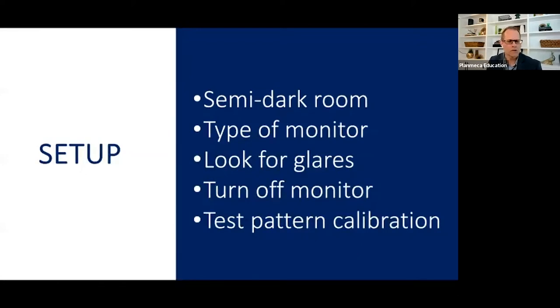One of the recommendations I would say is look for glares on your screen. So I have lights around me today that are cast so they are not providing glare on my screen. So the best thing you could do is turn off your monitor, not right now, but when you're in front of a 3D image, feel free to turn off your monitor and look at the reflections in the monitor to make sure that you're not getting any ambient light that might be reflecting off from some other object in your operatory or your private room or wherever you're viewing 3D images.